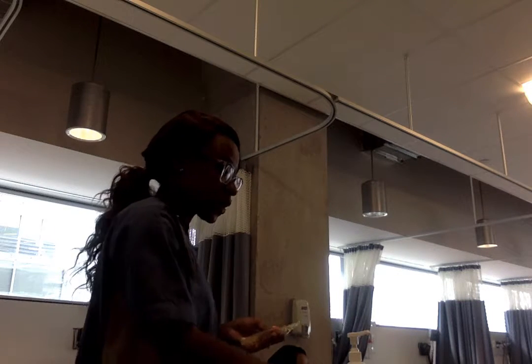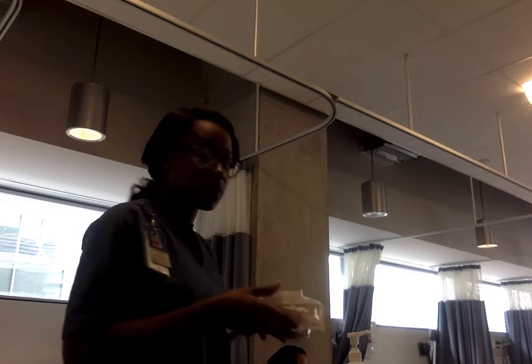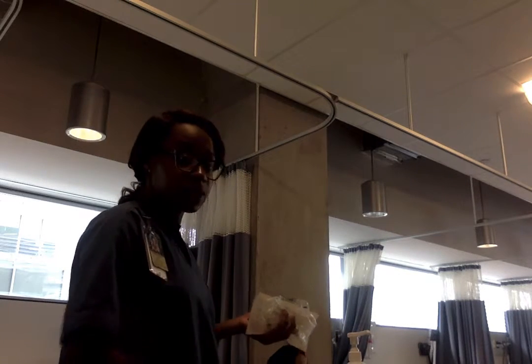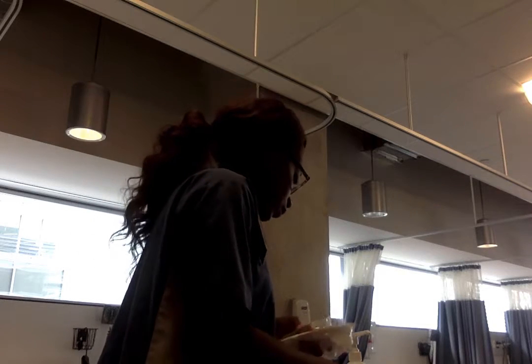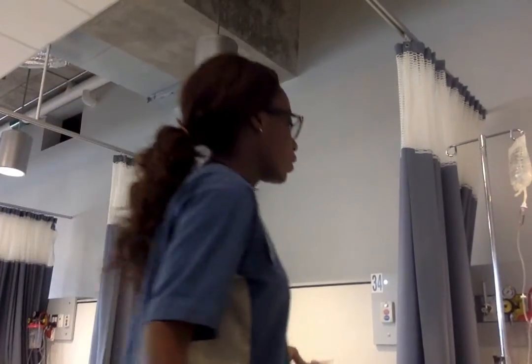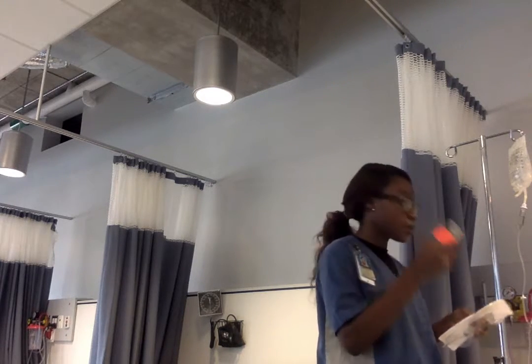So now I'm just going to go into my client's room with my secondary tubing, and dispose of everything I don't need. Okay, Mr. Tutu, I'm back. So I also confirm, making sure I have the correct medication with the correct client again before I even set it up. Correct patient, correct medication. So I'm going to start off by just placing this over here.